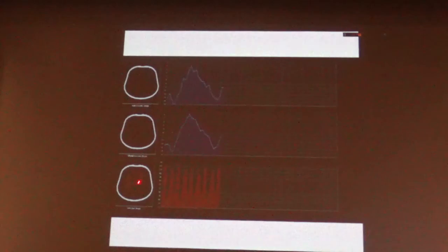We can see here that I don't see too much the heart. Now a little bit lower slice, more caudal slice, we see the heart. And the lung has a different shape. Unfortunately we cannot see here because the computer is slow. And also a caudal one, where you see only the dorsal parts of the lung because of the shape of the diaphragm. So you can really have a 3D, you can see here that you have only the dorsal lung moving.